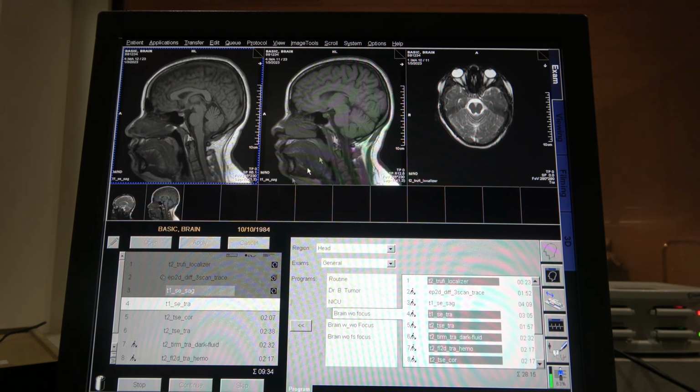So here's the sagittal that we ran, same one, okay? We're about to finish our axial right now. And sometimes it's good awareness to let the patient know how much longer, so that they're aware of how much time they've got left. Okay, sometimes 1 minute feels like 10 minutes in that scanner.